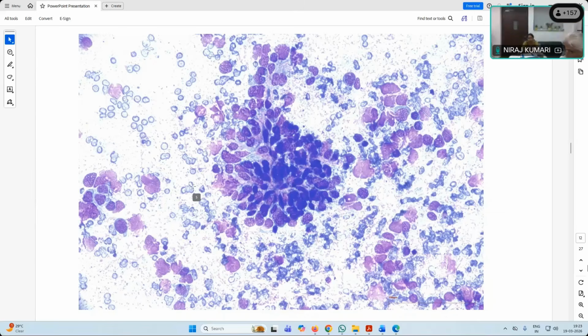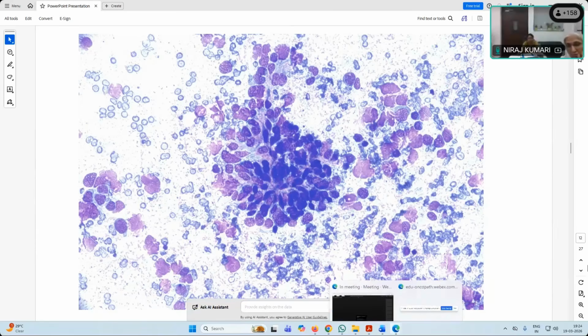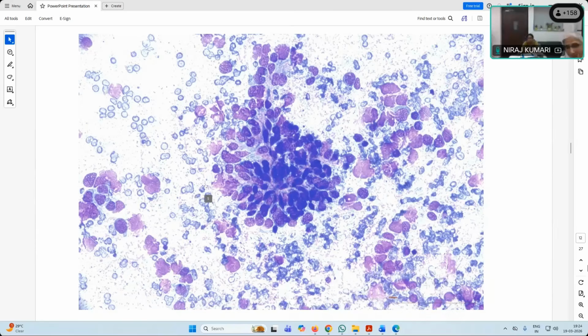Can it be a congenital lymphoma? Mesoblastic nephroma. Mesoblastic nephroma. Okay. Yes. Anybody is thinking of lymphoma? So no one is thinking about lymphoma. Does it look like lymphoid? Okay. So you don't have that very discrete round cells, lymphoglandular bodies. Here you see different types of cells.